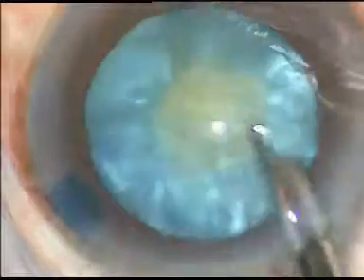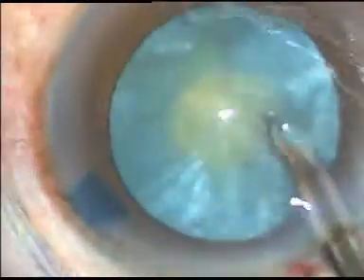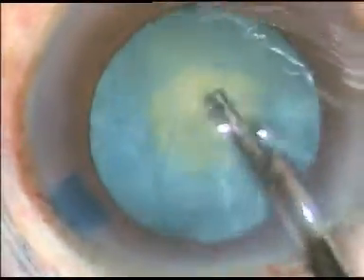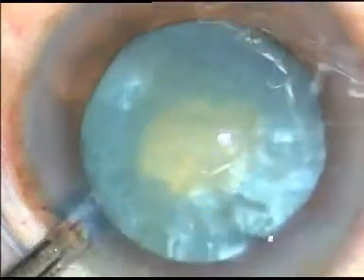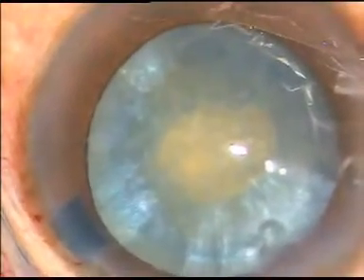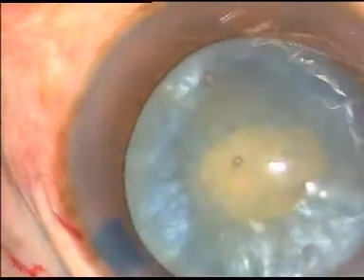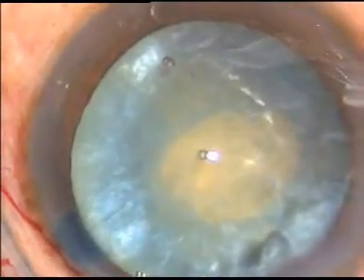This is loose. There is no adhesion between the capsule and the lens matter, so the nucleus is rotating. Now, once this is done, viscoelastic substance is again used to deepen the antechamber, used over the surface of the cornea to have a better clear view.